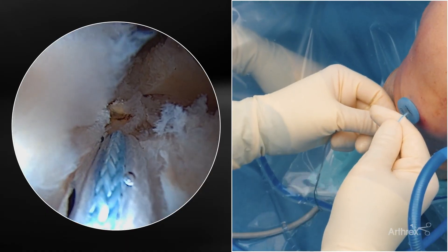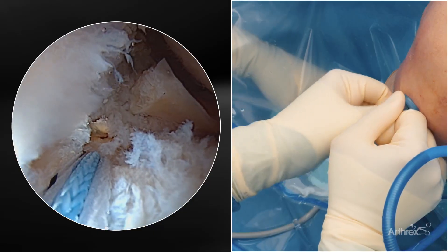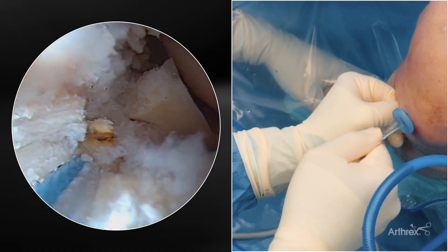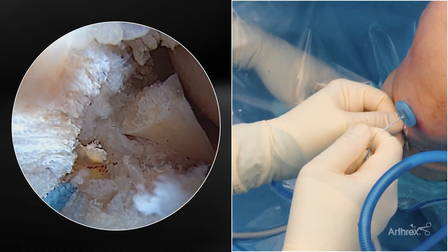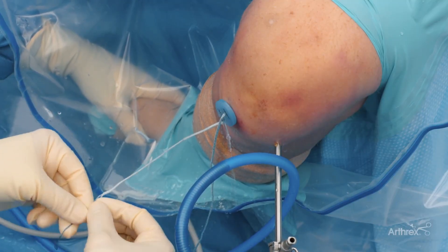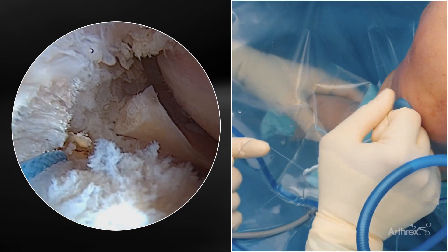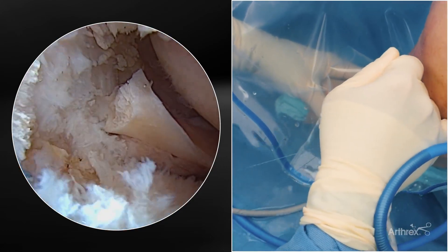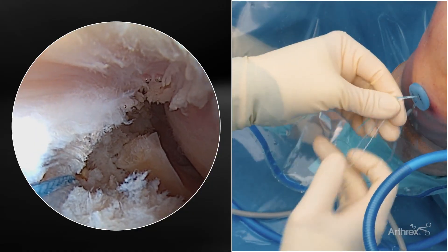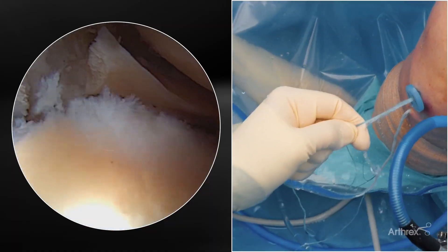The key is you want to make sure that the mechanism that's going to be bunching the SutureLock is just under the tibia. I gently roll my finger or pull my thumb down in a controlled fashion and you'll feel just a little tiny clunk as it comes into the tibia. To deploy and bunch up the sheath under the tibia, gently grab the four sutures out of the passport. Put your finger against the passport for a controlled pull and gently pull this back to set the sheath. You will feel a little bit of give and then the sutures will stop moving. I then do the setting suture which comes out the tibia — the black and blue suture with a loop — and pull this down in a toggle fashion to set the sheath. Pull all four sutures and confirm you get no play or movement, and now you know the sheath is fully secured against the tibial plateau.